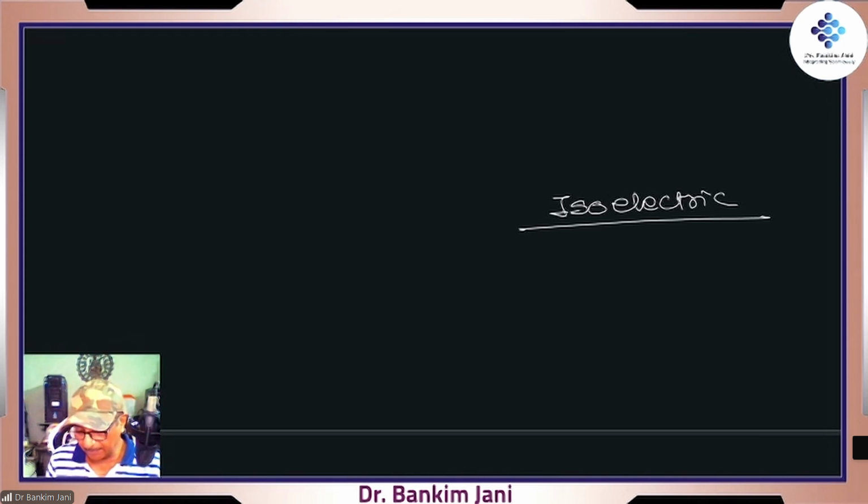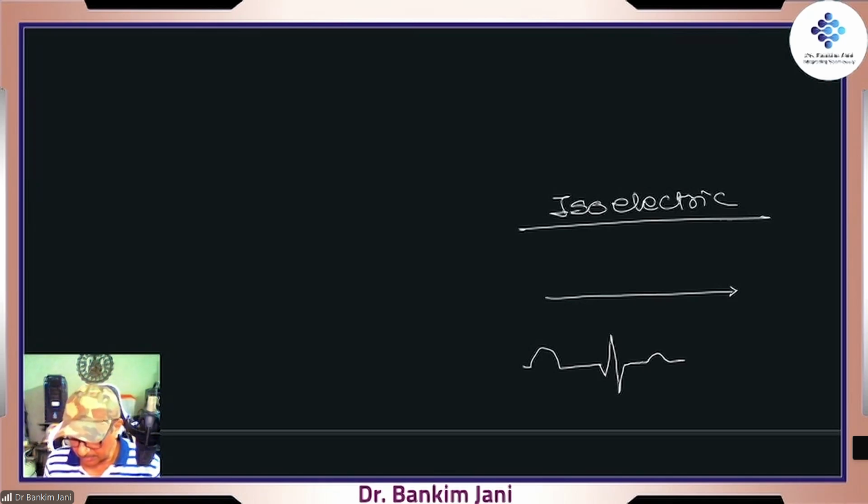Isoelectric means at the same level. So P, and now this phase, and then the QRS, where some activity is going on. This phase is isoelectric.